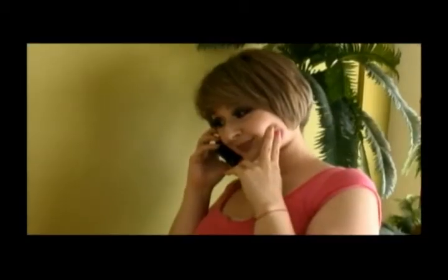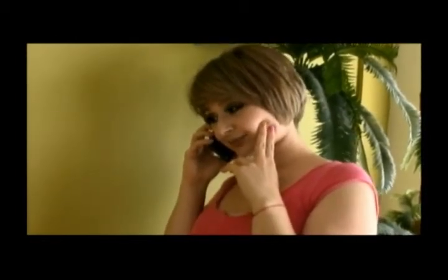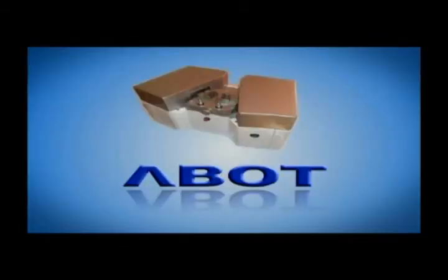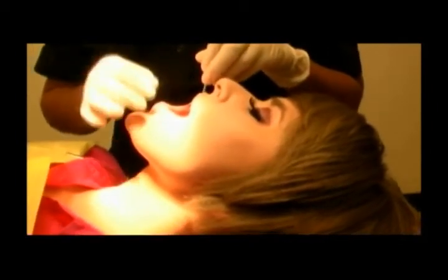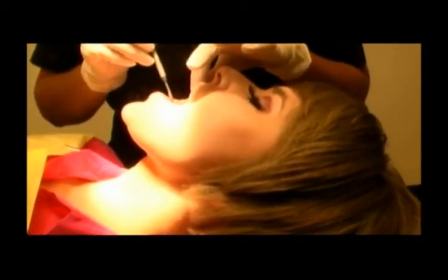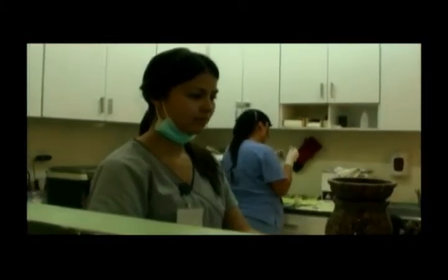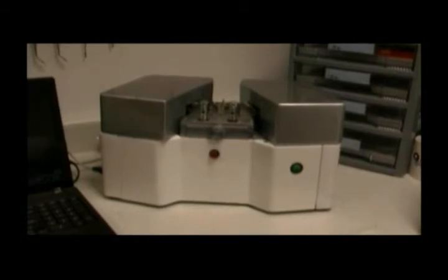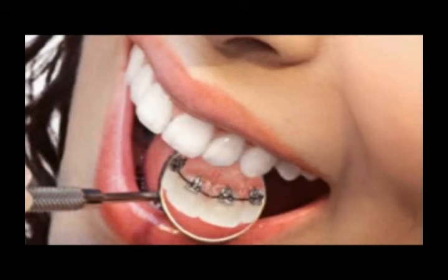We all know that eventually our patients may break a wire due to use or treatment conditions. Being able to count on Lamdabot for these emergencies is priceless because it allows us to immediately replace the broken wire, even when the patient arrives on short notice or no notice at all. This small but important detail will be appreciated not only by you, but more importantly by your patients. All these features make Lambda System with Lamdabot a complete and practical in-house solution for your lingual orthodontic practice.